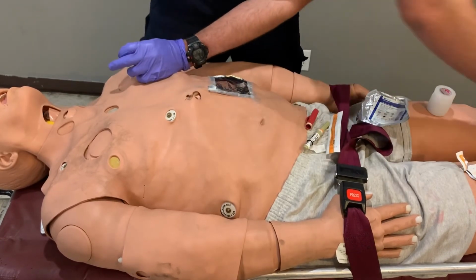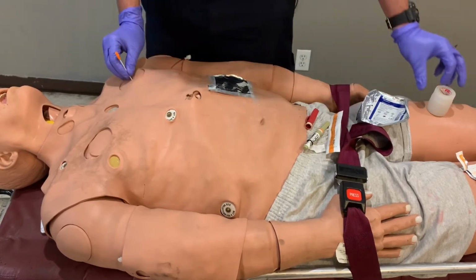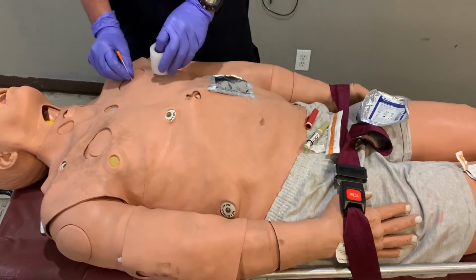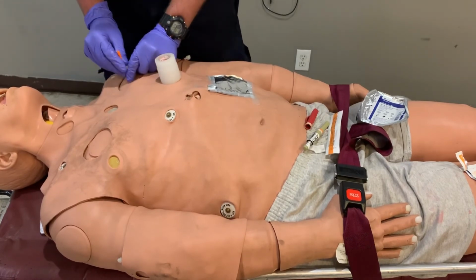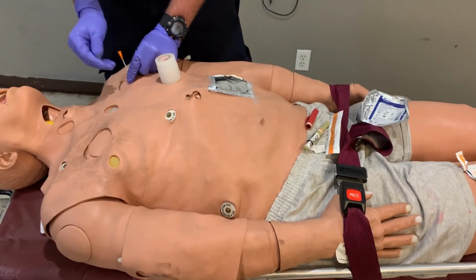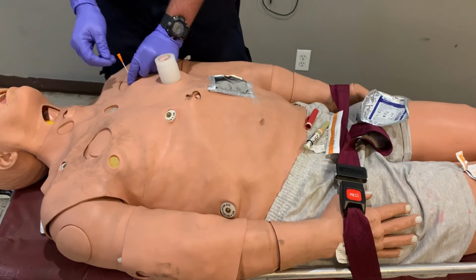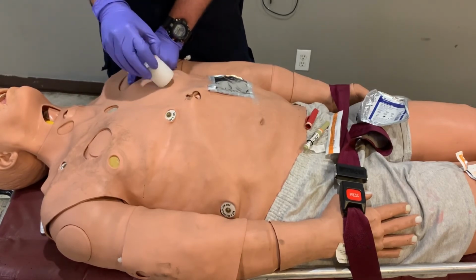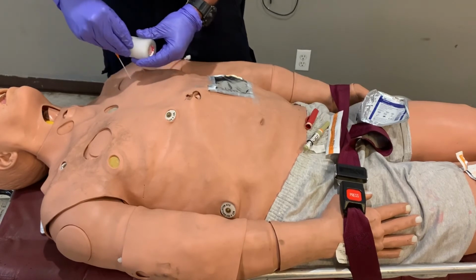dispose of the sharps, and then, if you do have one, you'll want to put a kind of switch on the catheter, making it so you can either open or close the valve, making sure that the hole you just made doesn't let air in.